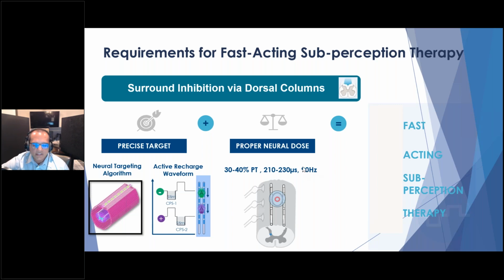I will say, as a side note, from a clinical standpoint, this, in my experience, does not apply to abdominal and pelvic pain. So I have another story of a patient who had severe pelvic pain. Getting that paresthesia overlap is very difficult with abdominal and pelvic pain because you don't have that dermatomal representation.